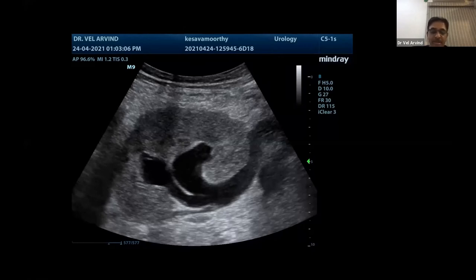It's not easier said than done. It's a very, very tough thing. I'm personally involved in it. And we can tell the surgeon, if it's near the bladder, okay, an extraperitoneal approach may be best. But if it is close to the pelvis or mid-ureter, you have to go intraperitoneal, so you can make a connection to the native ureter. Before that, native ureter anatomy should be delineated properly.